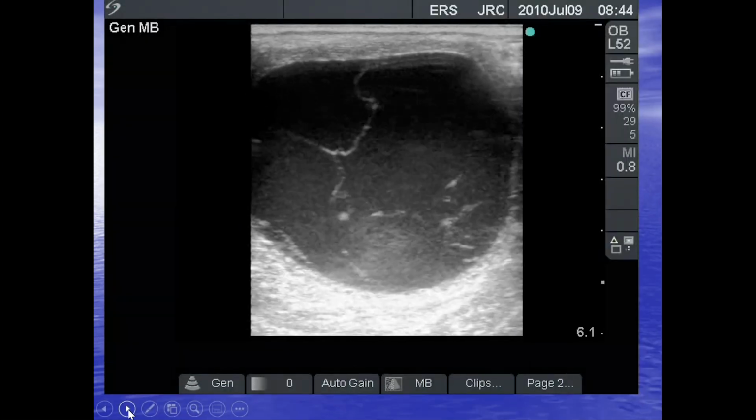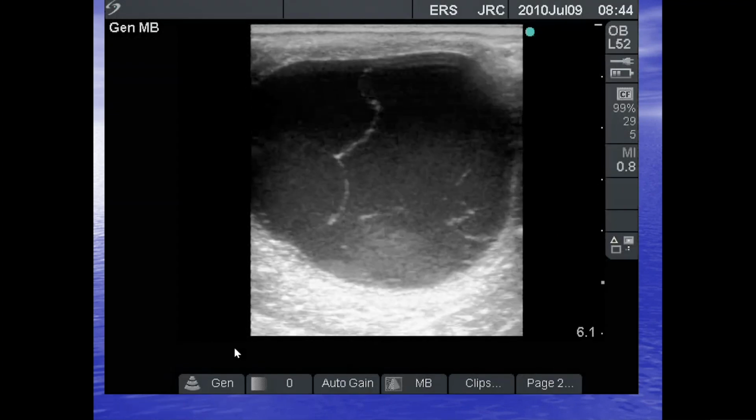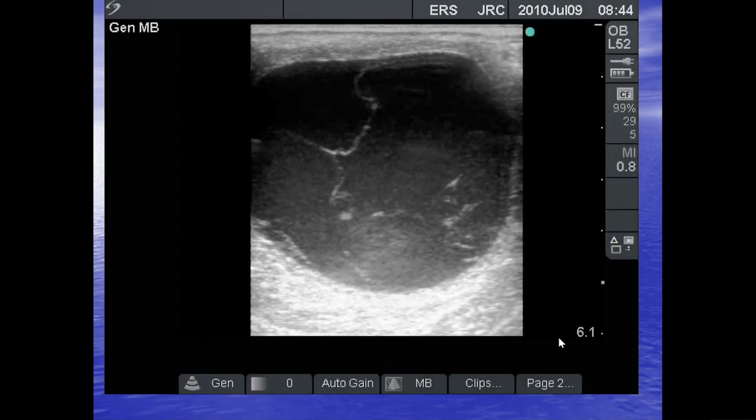What do we think of this? Absolutely bizarre looking structure. I think in the past, before we had good assays to detect it, we would have said this could have been a granulosa cell tumor. I always blot these, and if the strands wave, as in this case, you'll see when I take it off frozen in a minute, the strands move around, then I think that's indicative of an anovulatory hemorrhagic follicle, not a granulosa cell tumor.